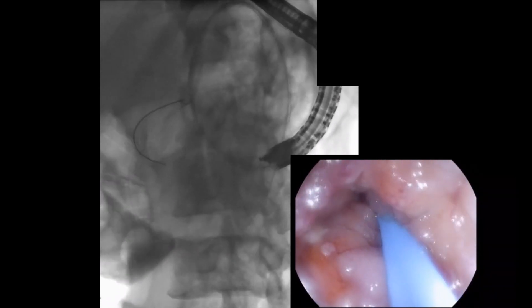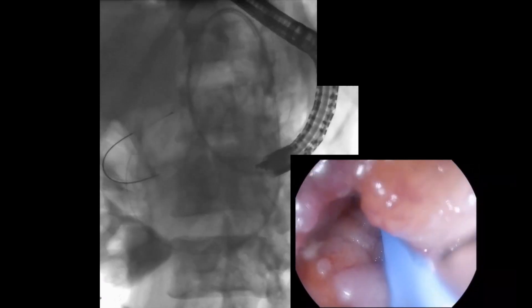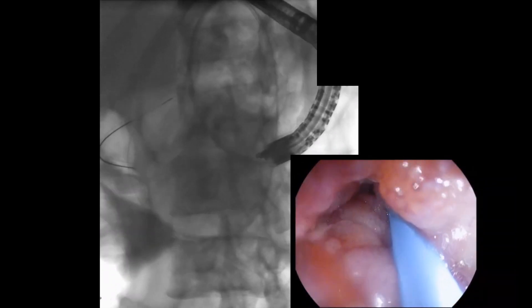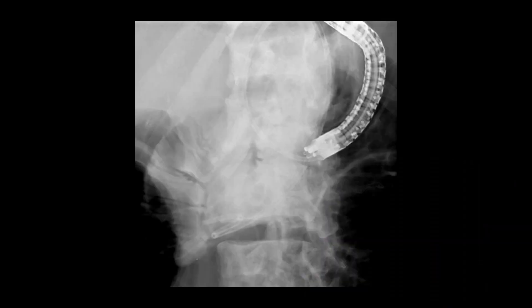Next, a 7-French nasocystic catheter was passed over the guidewire and advanced past the obstruction into the proximal jejunum. The gastroscope was subsequently removed, leaving the nasocystic drain in place. This was attached to a water jet, allowing infusion of a large volume of dilute contrast mixed with methylene blue into the small bowel.